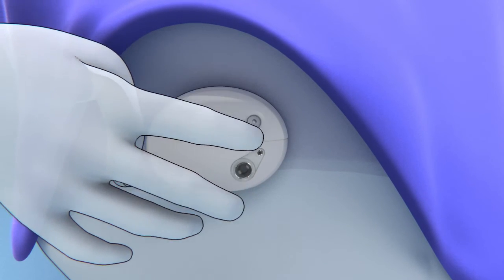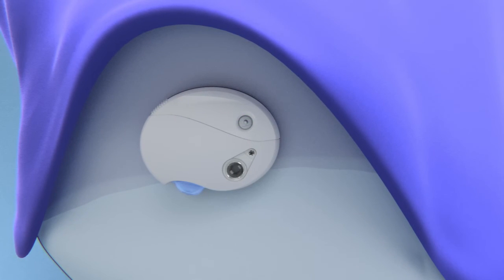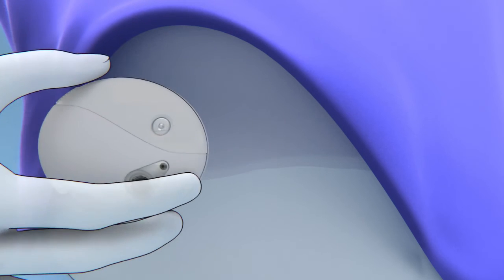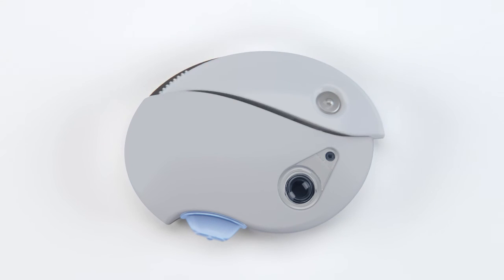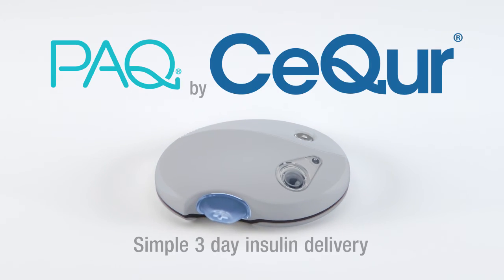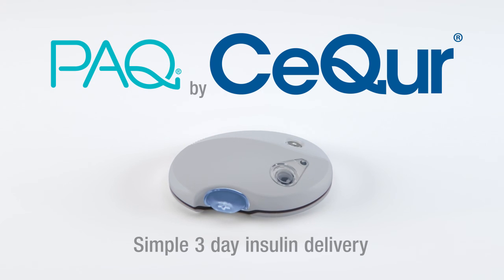By pressing the messenger unit button, a discreet vibration will indicate if it's time to change the device. After three days, PAQ is simply removed and the messenger unit is attached to a new infuser. PAQ provides all your insulin needs, enabling a life free from the burden of insulin injections.